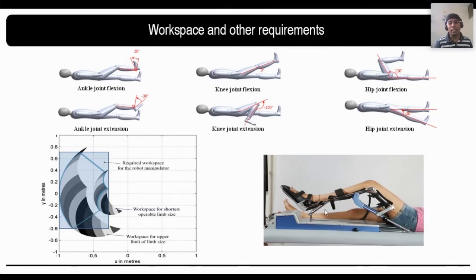So this is what we call CPM, or continuous passive motion. When somebody is developing a system, this is also supposed to be an inbuilt system. So if we consider all these kinds of aspects, we can come back with several configurations. But accidentally we came up with one configuration.